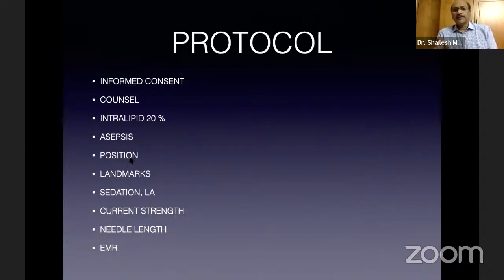Then the position of the patient is important. These blocks can be given in supine position, lateral position, even in prone position. Then landmarks, as I told you, have to be properly felt, because a lot of patients are obese, where these landmarks are not very well felt. Then because the gluteal, subgluteal areas are deeper blocks, longer needles are required.